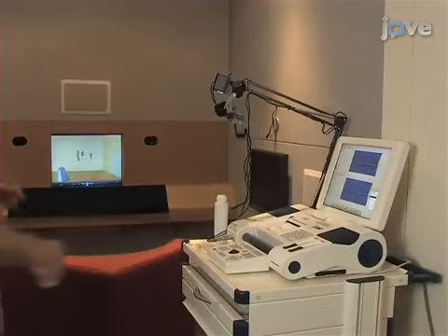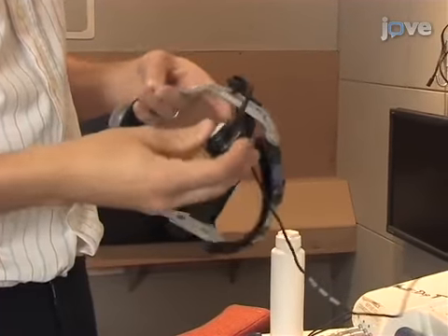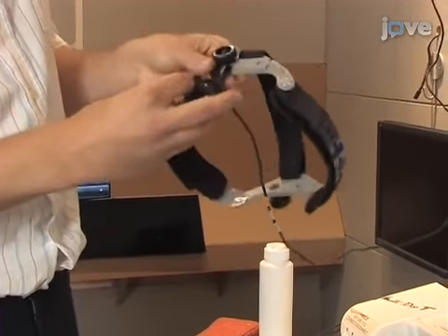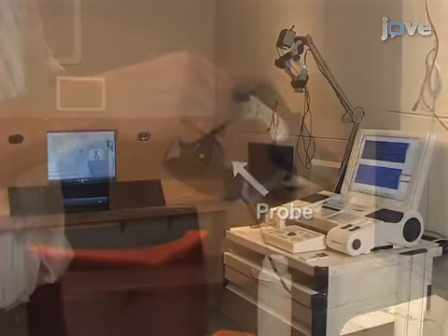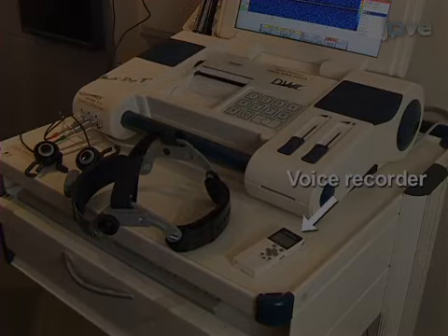This video will demonstrate the use of functional transcranial Doppler ultrasound, fTCD for short, to assess language lateralization in children. The system consists of a multi-dop with ultrasound probes attached to a headset, a stimulus computer that will be used to show videos to the subject, and a voice recorder for auditory responses.